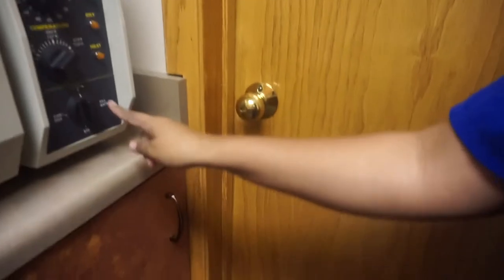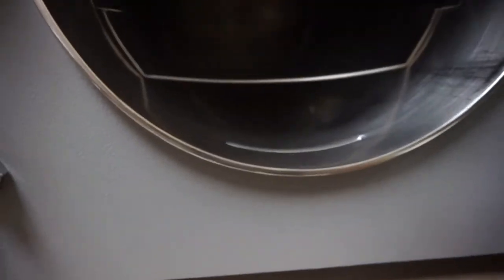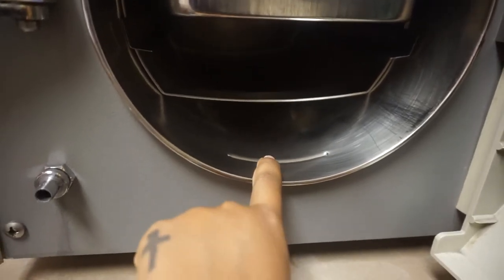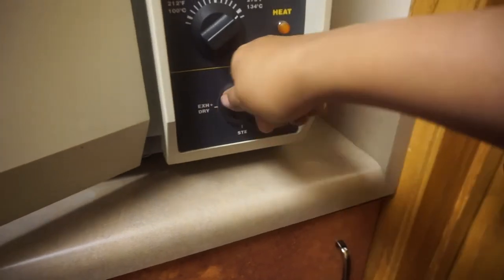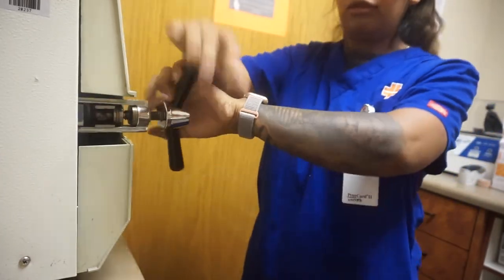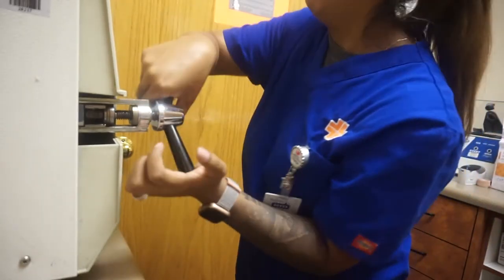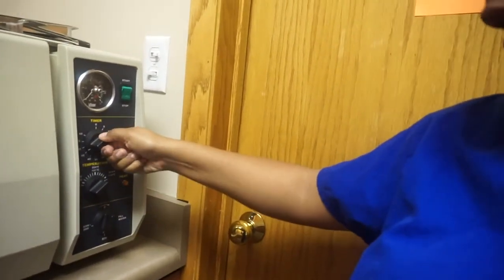So we're actually going to fill water — you're going to see the water filling. As soon as the water touches this little ridge, we can start it. I'm going to go ahead and change that to steam. Now I can close it. We're going to close that tight, then we are setting this to 45 minutes and we just push start and wait for that cycle.